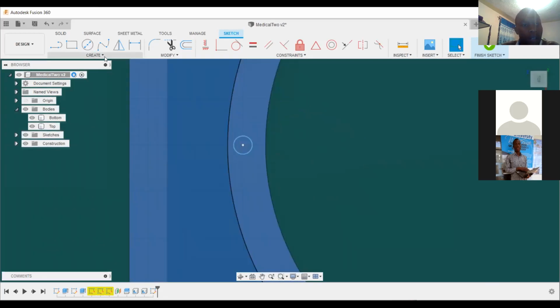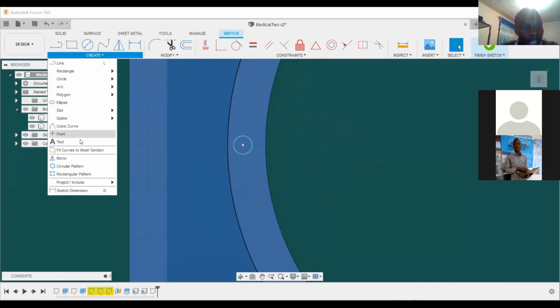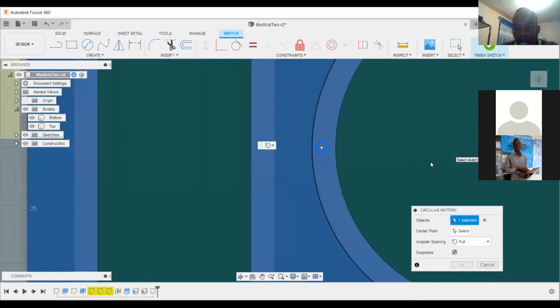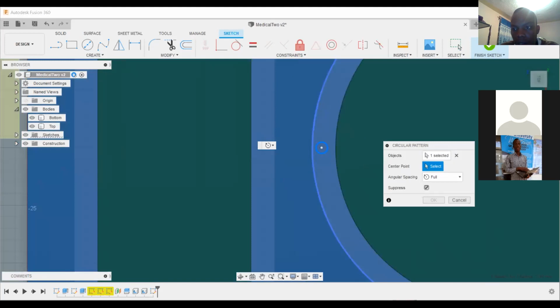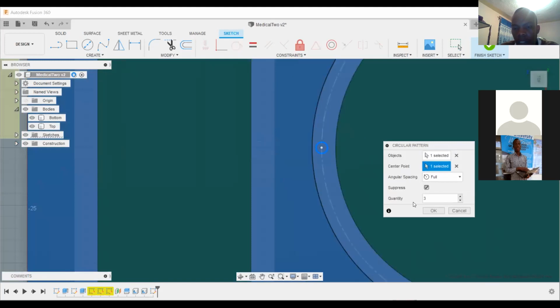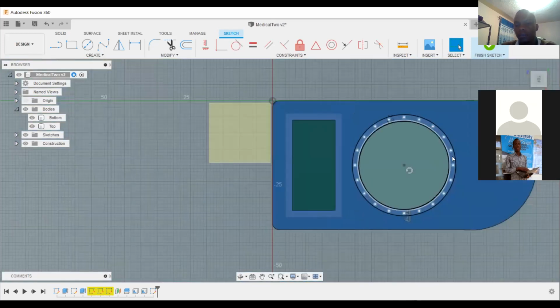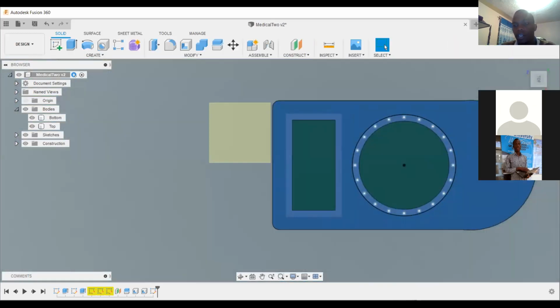So I've drawn this. I'm repeating this again. Create a circular pattern of this circle. Then select the center here. Then you choose how many you want them to be. You can do like 20. Then it will be like that. Then you finish the sketch.